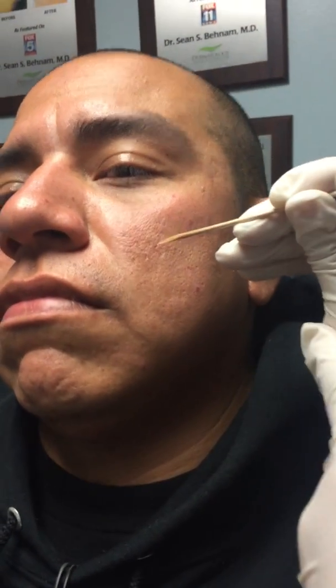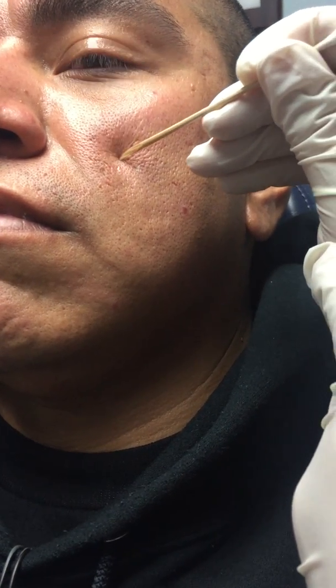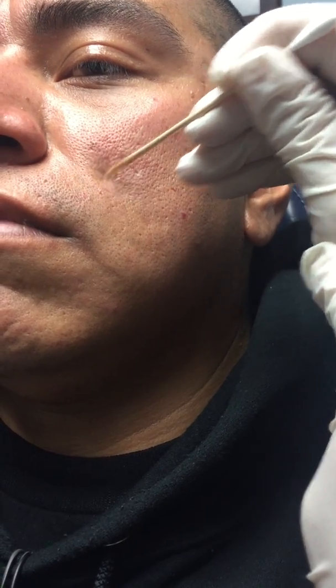Surrounding the white spot, it's going to turn slightly red. I typically let the patient sit in my office for about 10 to 20 minutes to make sure everything's okay, and then they get to go home. Typically in darker skinned individuals, I like to use TCA 80%. I believe it's as effective. You can see how I'm going right into the acne scars and it's frosting up. I also use it for box car scars as well.